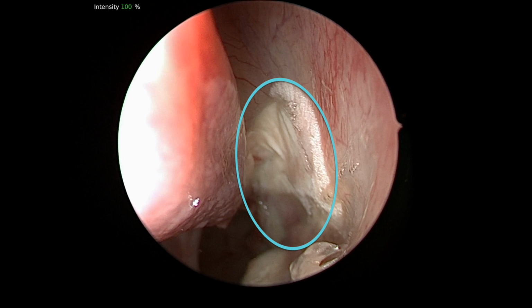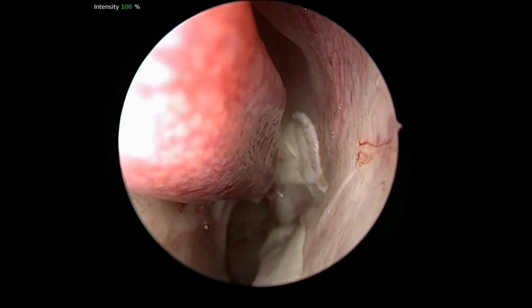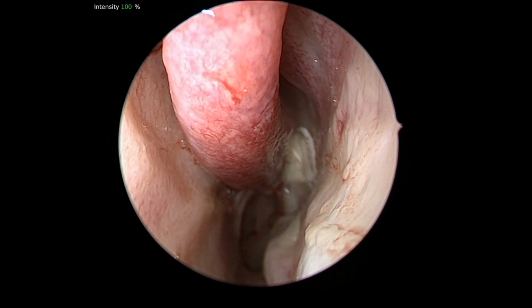As you can see, the surgeon has been very successful at achieving that target zone of cryotreatment in the posterior inferior aspect of the middle meatus, right at the insertion of the middle turbinate to the lateral nasal wall. Again, you can see the zone of cryotreatment relative to the more familiar structures of the middle meatus, the uncinate process, and the bulla ethmoidalis behind the uncinate. Again, note how inferior and more posterior we are relative to the other structures of the middle meatus.